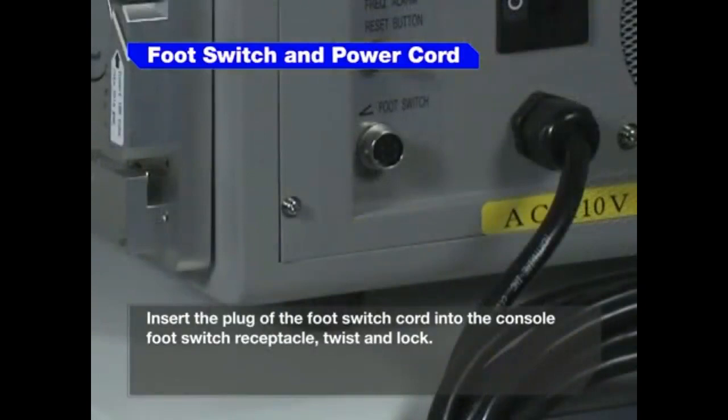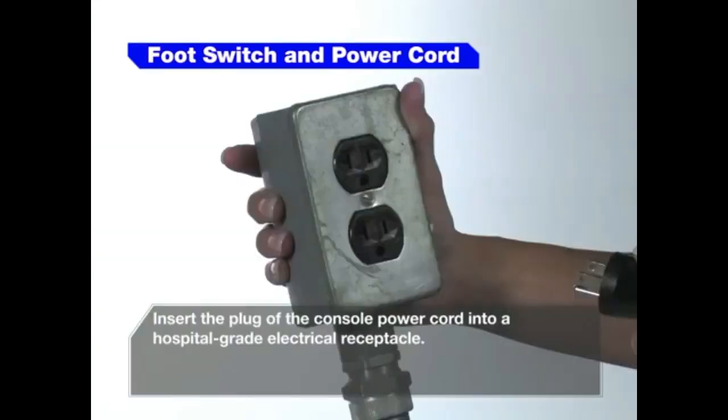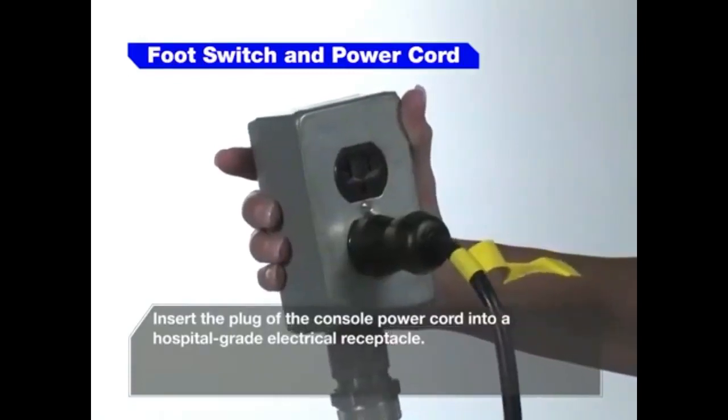Insert the plug of the foot switch cord into the console foot switch receptacle. Twist and lock. Insert the plug of the console power cord into a hospital grade electrical receptacle.